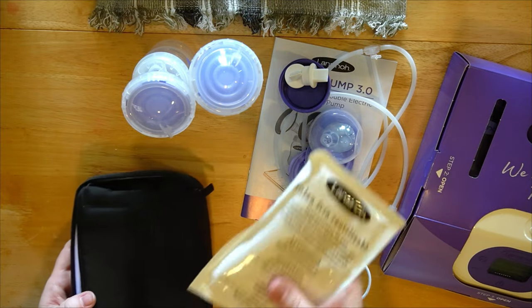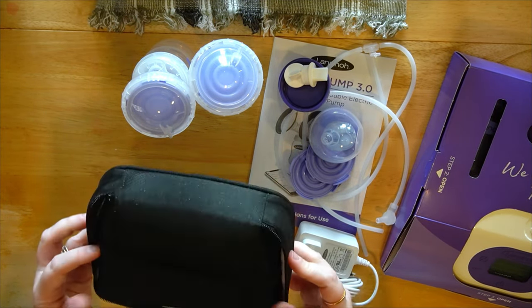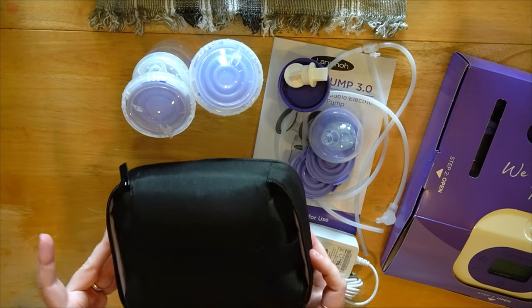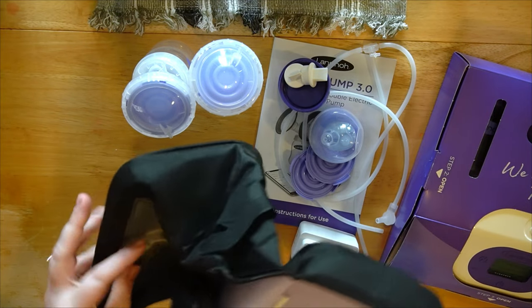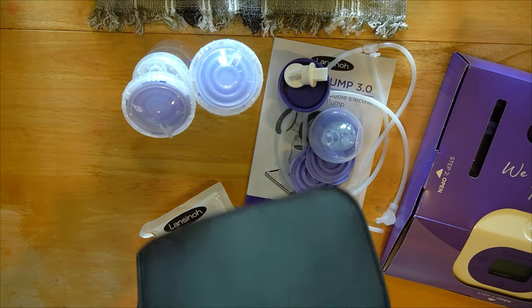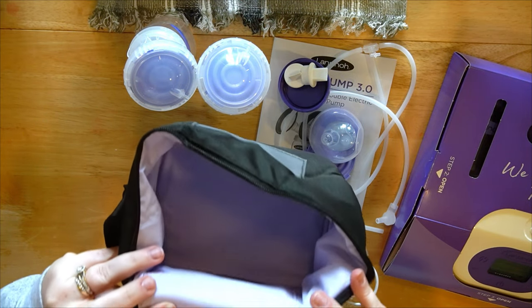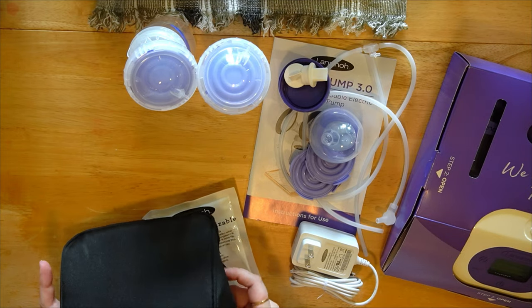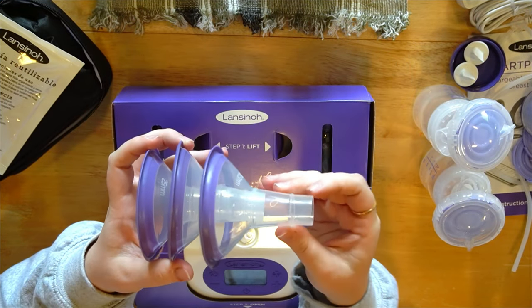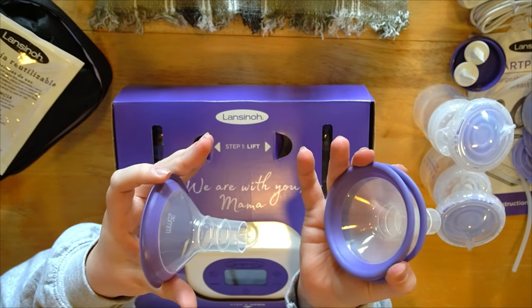They also included a freezer bag — I thought it was actually a short little bag good for bags of milk, but it's not. It's just folded up, so it actually is a pretty full-size cooler bag. You can fit a full bottle down in there. It was just folded up really nicely — I'm going to fold that back down.